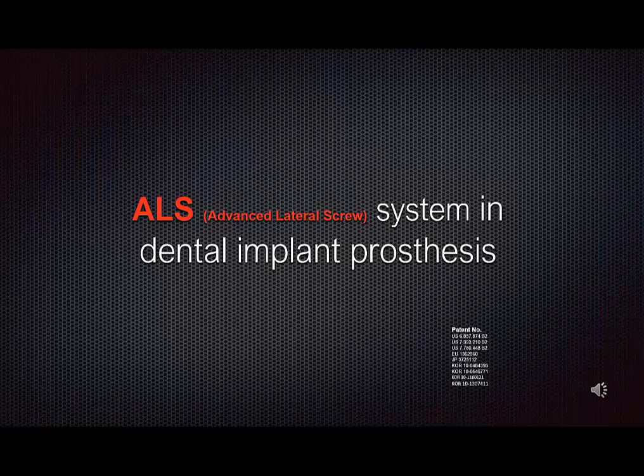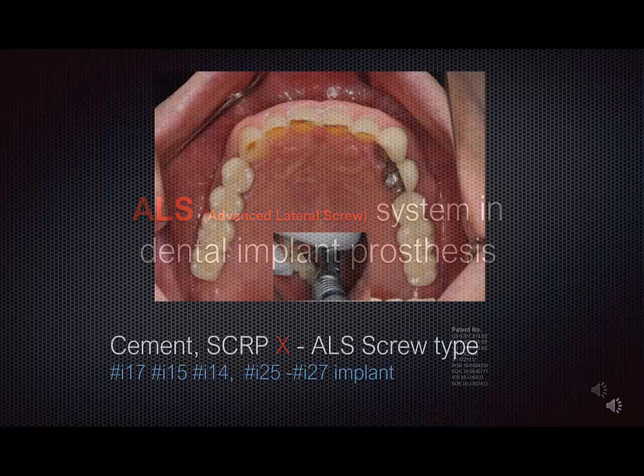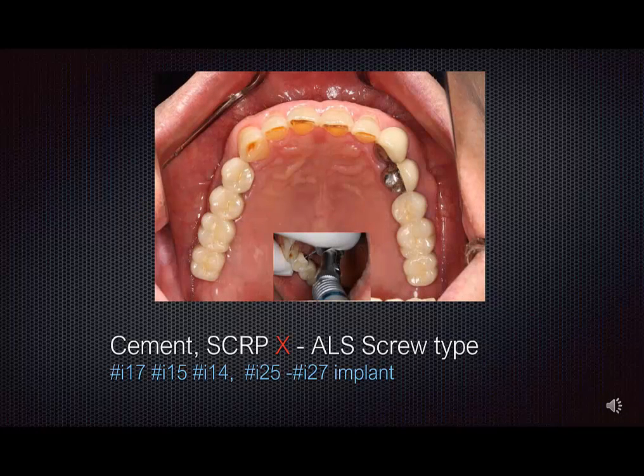Introducing the newly developed ALS system for dental implant prosthesis. This is a photograph of both implant prostheses made with the ALS system.